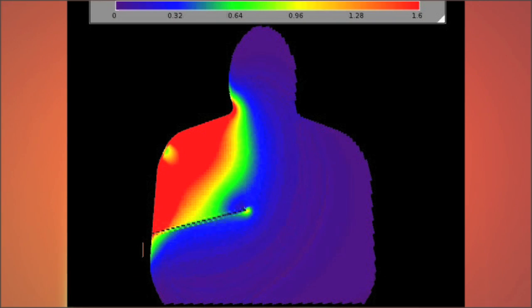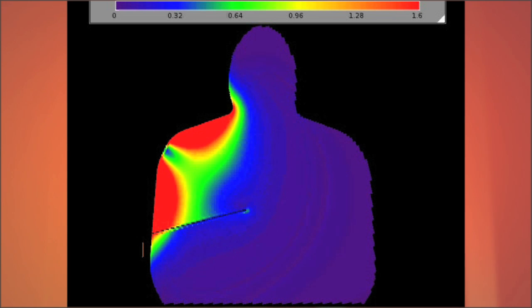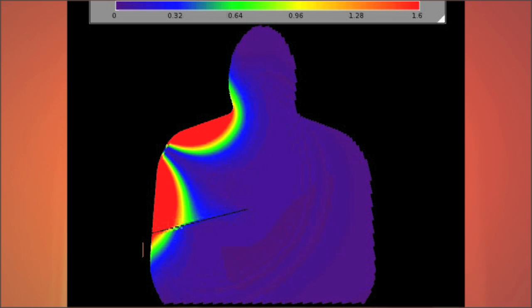When you are in tune, an optimal transfer of energy occurs between the regenerator and the patient, allowing therapy to begin. An electromagnetic field is created between the patient and the coils inside of the therapy garment, and that specific field is now set to work with the regenerator. This is important because if the field changes, the garment will go out of tune. The specific field can change for a few reasons.